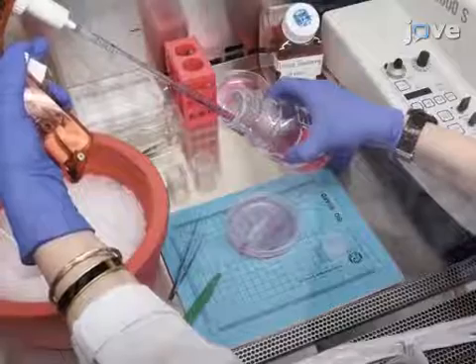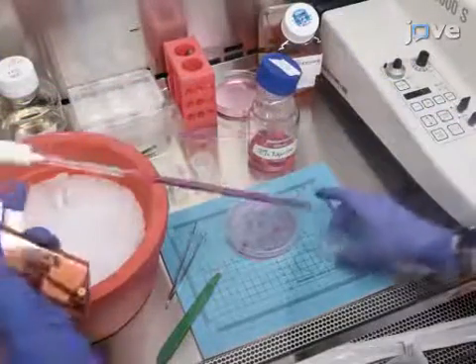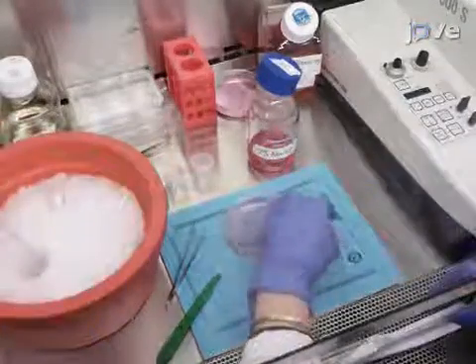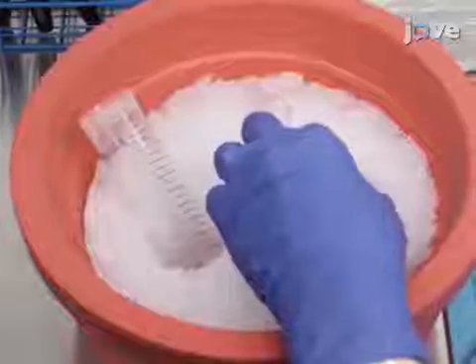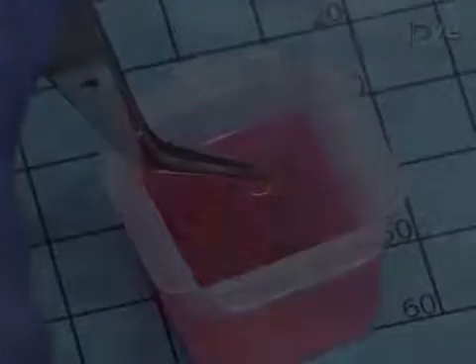When all of the tissue has been trimmed, add 5-7ml of 37 degrees Celsius liquid agarose into a 2-3cm plastic embedding mold and chill the agarose on a bed of ice for 1 minute. Place 2-4 strips of tissue into the agarose with a long axis oriented vertically.